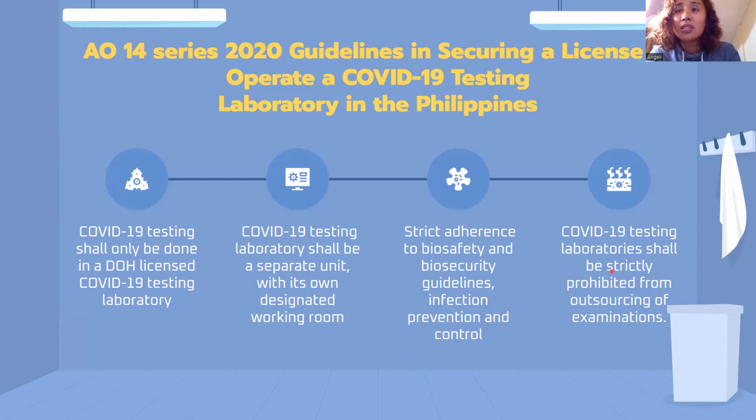It is strictly prohibited from outsourcing examination. So for your RT-PCR, you cannot outsource it or let another laboratory test it for you.